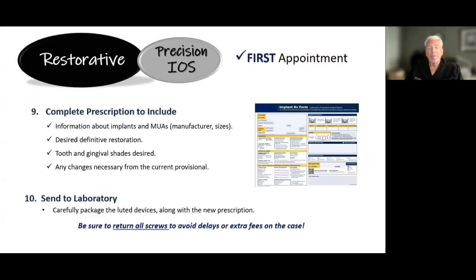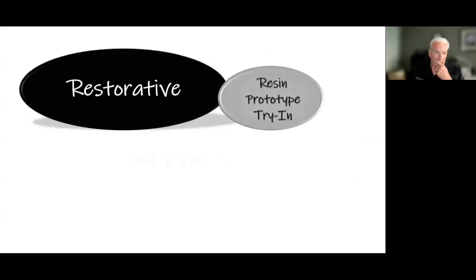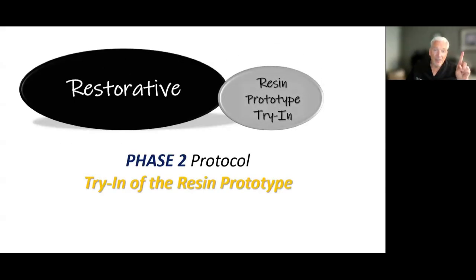If you're sending some of these luted scan bodies together, make sure you pack them well. It's embarrassing sometimes opening these boxes and seeing how some people are packing these things. Pack them with care. It's very important, so patients don't have to come back. That was your first appointment for working toward the final.